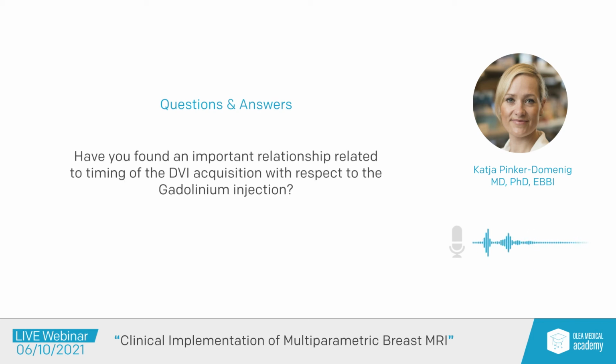Yeah, in general, it is recommended to do it before injection of gadolinium. However, some institutions perform it after, and there have been studies showing that it slightly changes the ADC values, but not in a diagnostically significant way; if anything, it makes them slightly lower than higher. So it's not that you will overlook a cancer because you did it post contrast.